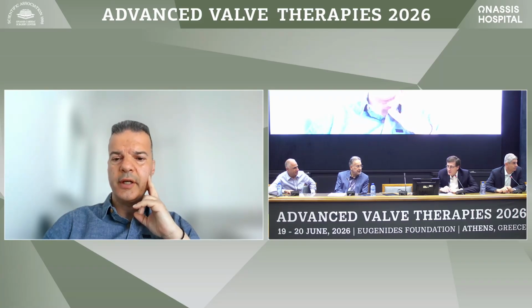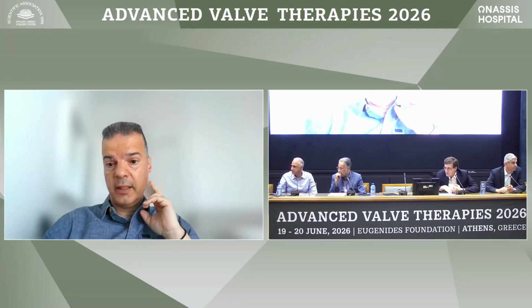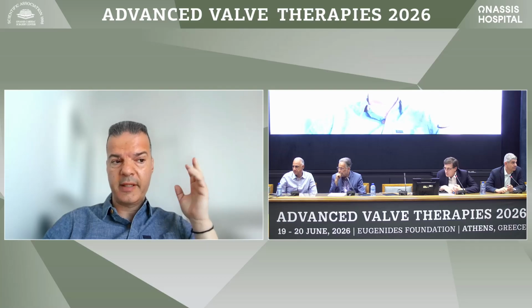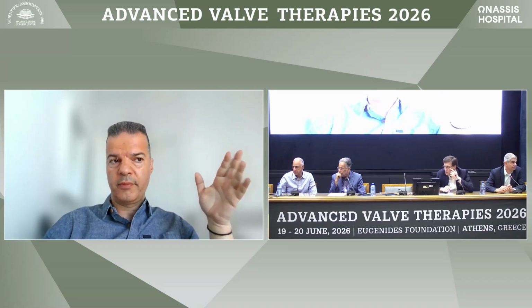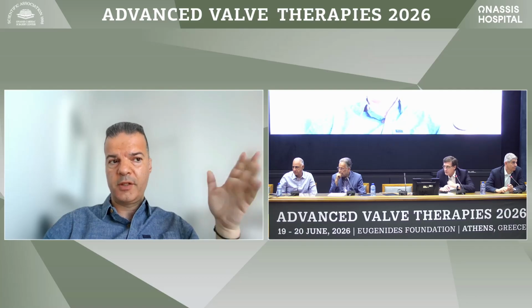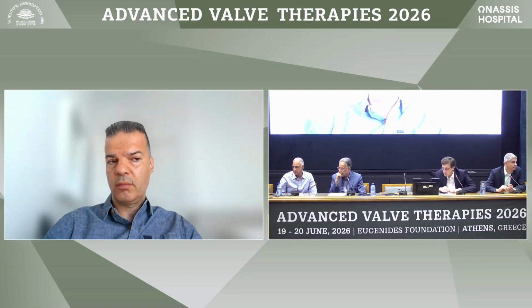Well, out for consideration then. I share these concerns. Yeah, go ahead, Lassi. If I can make a quick comment, I do share these concerns. And obviously, Michalis is extremely experienced, and we all know that it might not be feasible to perform Clover in all patients, especially in the posterior area. There might be anatomic variations that will prevent you from actually being successful. And you're also running a risk of SLD or getting trapped in the cords.